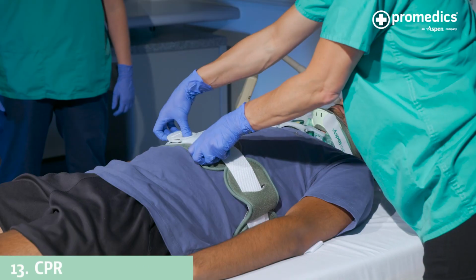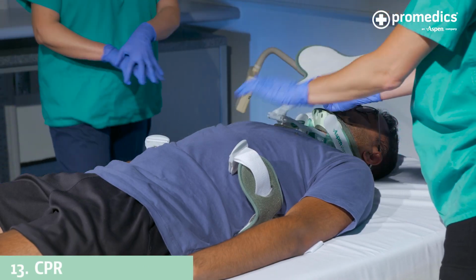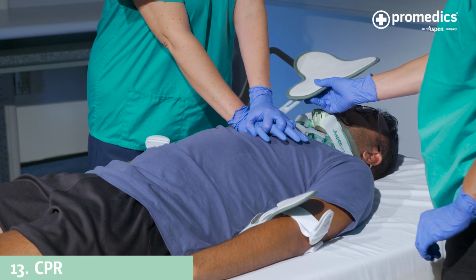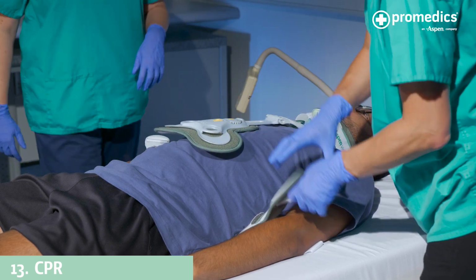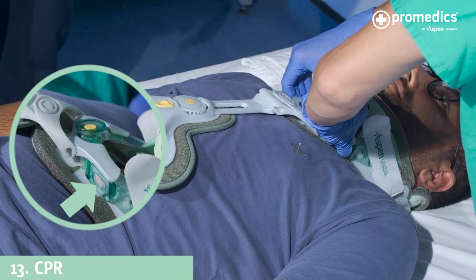Press and unclip the two front straps, spread the yoke, flip the front section up and start compressions. Alternatively, you can unclip and remove the front section with the two front clips at the bottom of the collar.